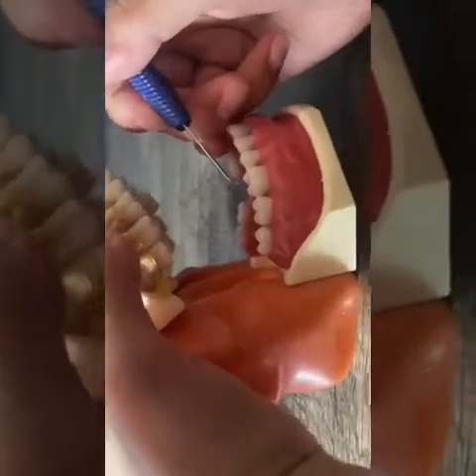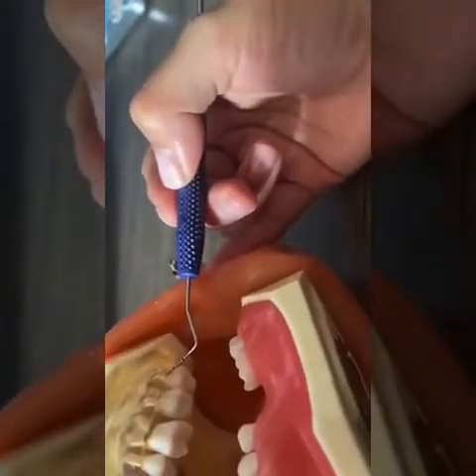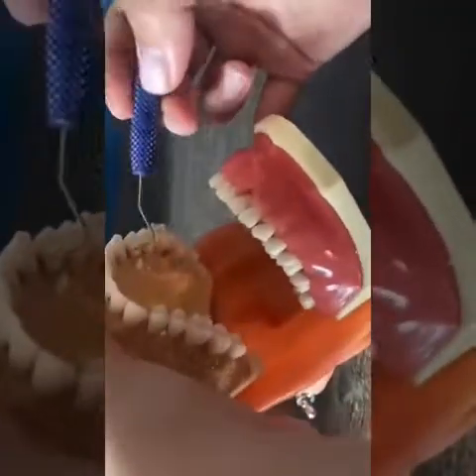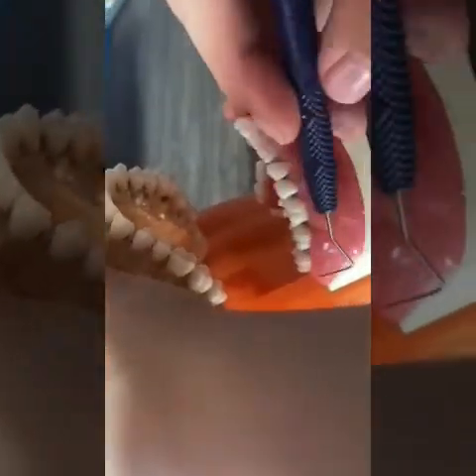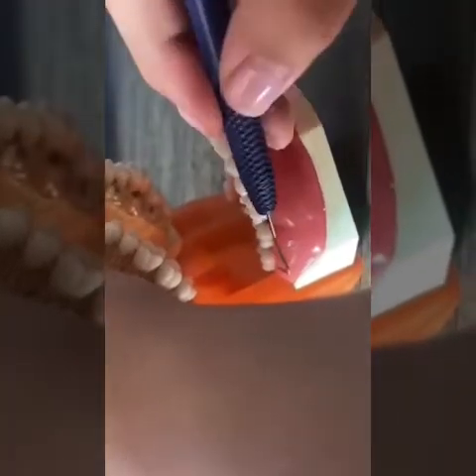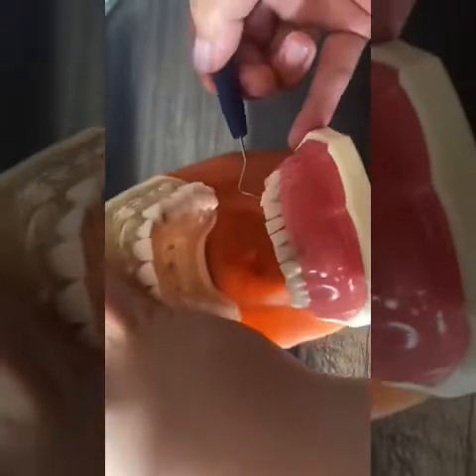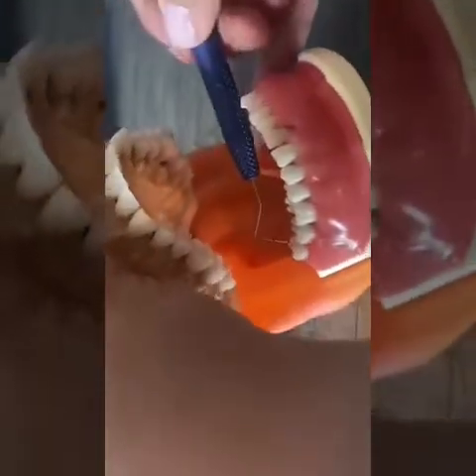When you start to take measurements of the whole mouth, we always start at number 1, so it's the upper right. You start at number 1, facial, all the way to number 16, on the upper left. And then you go on the palatal from 16 all the way up to 1 again on the palatal. And then you drop down to 32 on the buccal, and you measure all the way around to 17. And from 17, you go on the lingual, all the way to 32 lingual. So you're stopping at 32 lingual. That's where you end your measurements.